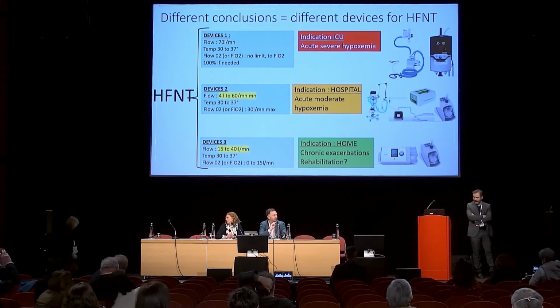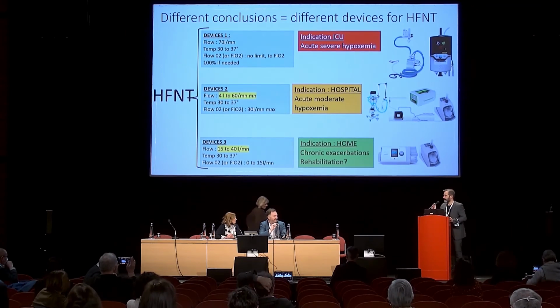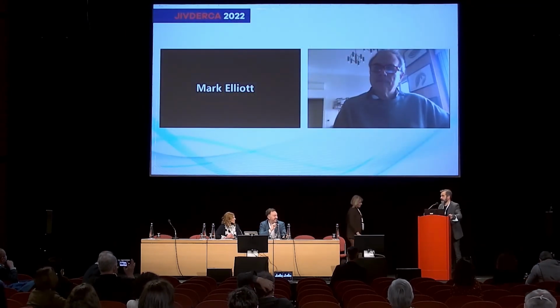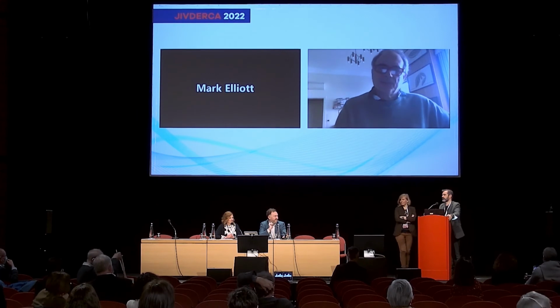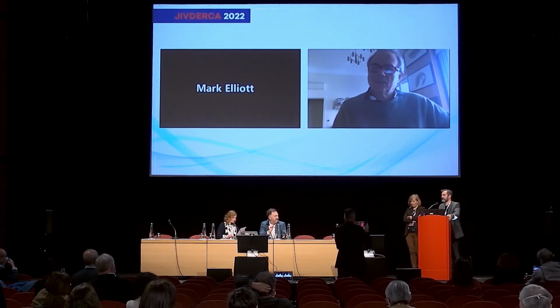Your talk is really consistent with your clinical practice, because you never prescribe high flow at home. No, never. Never, because if I would do it, it would be for decreased exacerbation. And first, there is no reimbursement in France. Secondly, for me, the devices, again, I repeat it, are very useful in the ward, and I perfectly know how to use them. At home, they are still complicated with humidification, the water, etc. So no, for the moment, I don't.